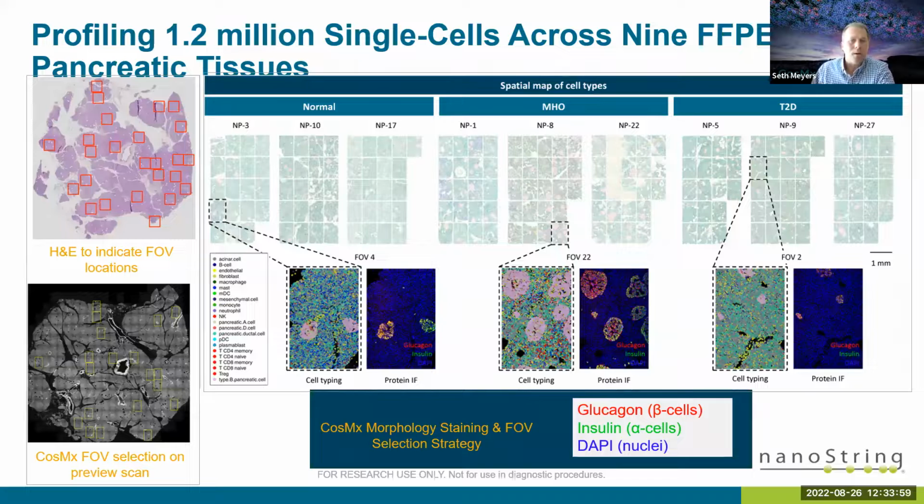Dr. Kolar is a pathologist by trade, and so he used an H&E stain to select the islets to focus specifically, rather than just the whole pancreas. For him, it was really important to avoid the digestive enzyme-secreting acinar tissue.